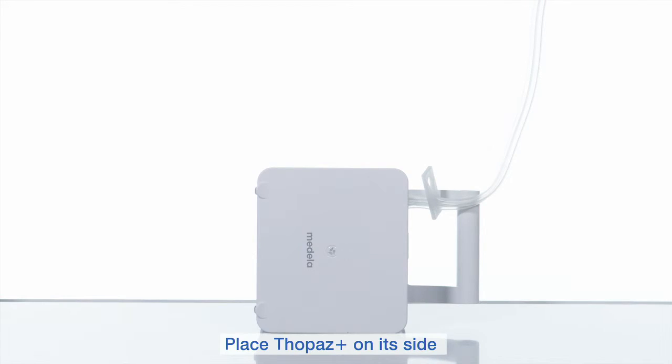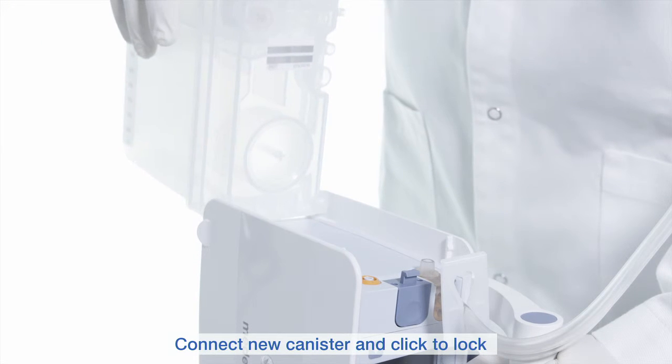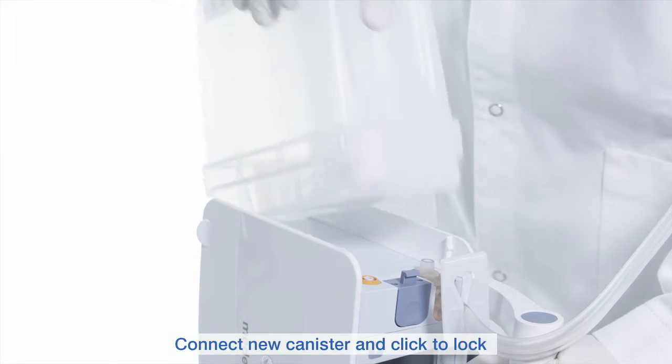Place Topaz Plus on its side for easier placement of the canister. Now insert the new canister as demonstrated and click to lock in place.